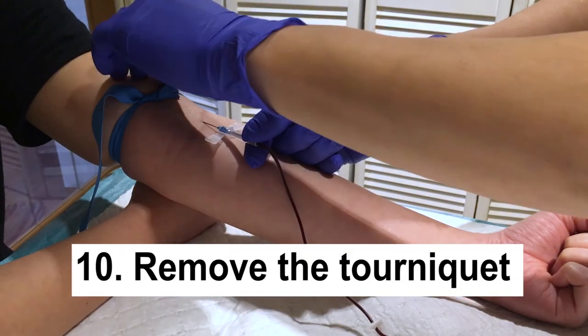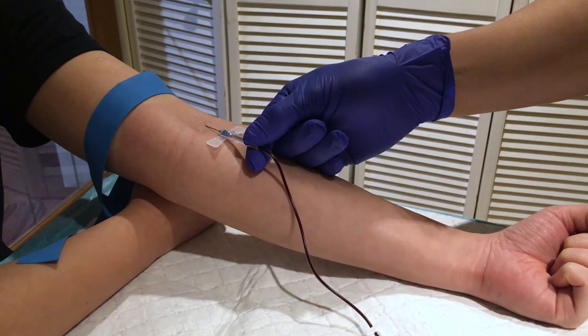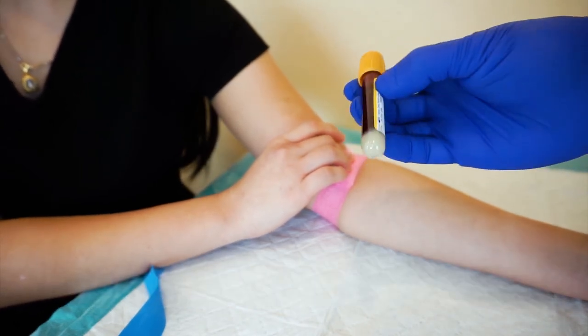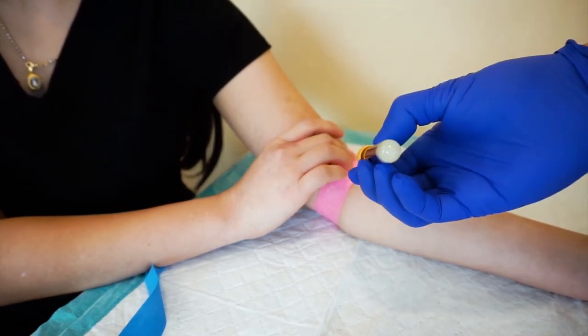Ten. As the blood is flowing, let the tourniquet go. Leaving the tourniquet on for too long will cause hemoconcentration and that will interfere with the test results. Eleven. Remove, then gently invert the filled tube a few times to prevent blood clots, and I said gently because you do not want to cause the blood to hemolyze.